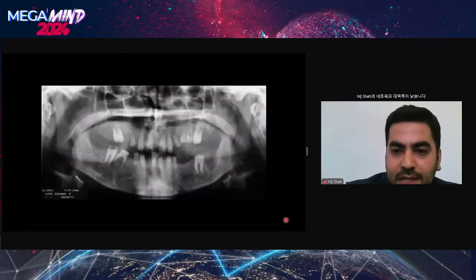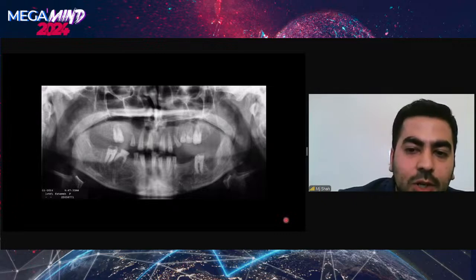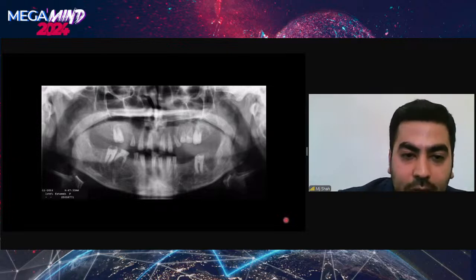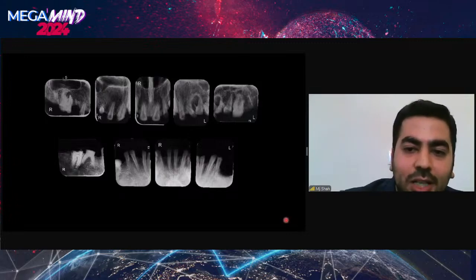This is the baseline for my work. In each quadrant, she only had central and lateral incisors and the first molar. Some deciduous teeth were also in her mouth. In these periapical radiographs, I evaluated the remaining teeth.